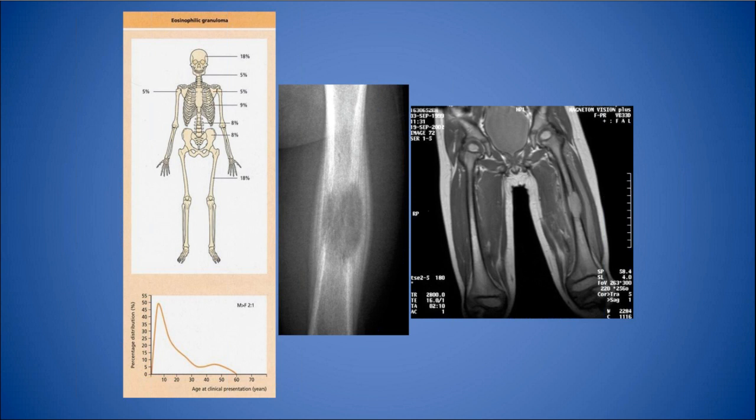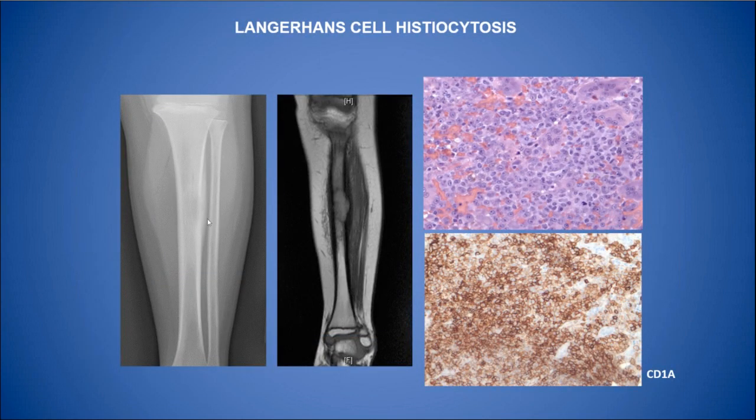Radiographically, Langerhans histiocytosis also shows a significant onion skin periosteal reaction, just like Ewing sarcoma, and like you may see also in osteomyelitis. So these three entities always go together in the radiological differential diagnosis. Here's an MRI where we can see clearly there is a mass in the mid-shaft of the femur. Another case, which is more subtle, we almost practically see just a tiny little area of lucency here and a very prominent onion skin pattern of periosteal reaction. So again, differential diagnosis is osteomyelitis, Ewing's, Langerhans histiocytosis.